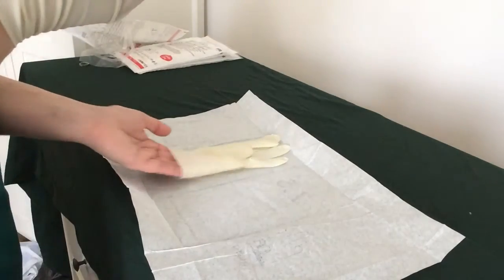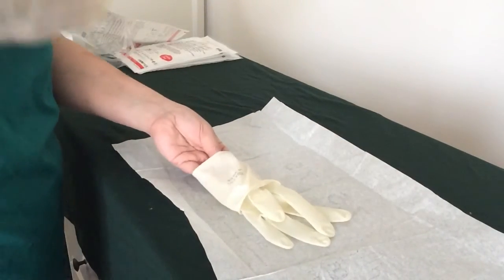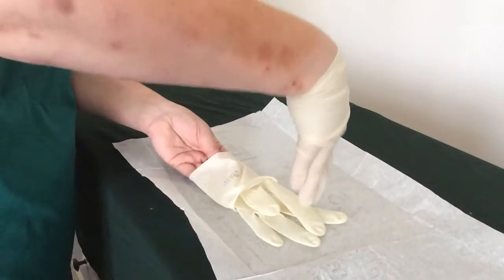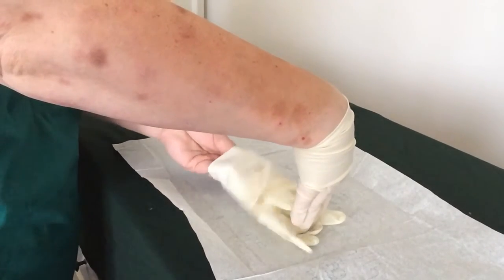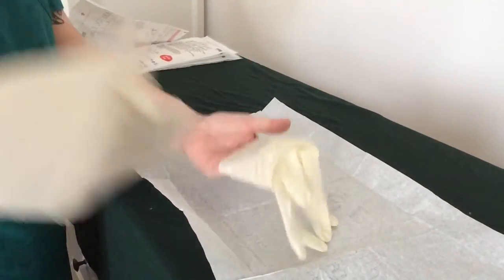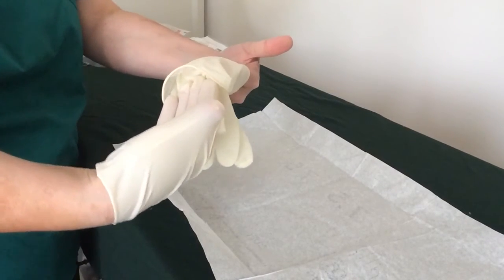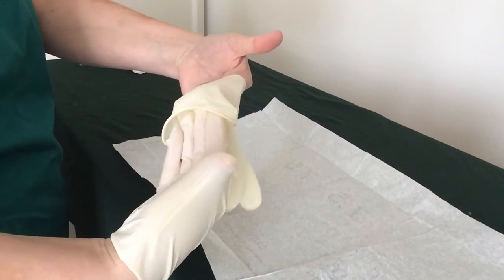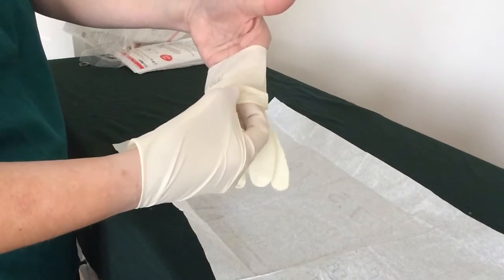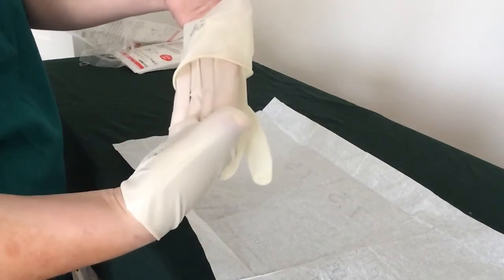Otherwise what happens is you push your hand in, your glove goes off, your paper goes everywhere, and it feels like you're losing control. So put outside of glove to outside of glove. That means I can slide four fingers in, then flip up — because when you flip up, you naturally create a little space for your other fingers to go in. This is where your thumb comes in. I always keep my thumb out, but the point of having your thumb there is that you could touch inside of glove to inside of glove if you wanted.